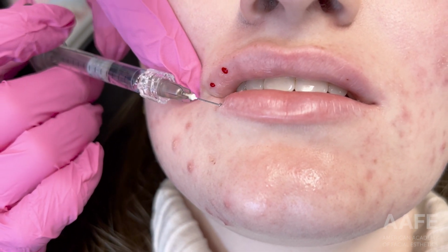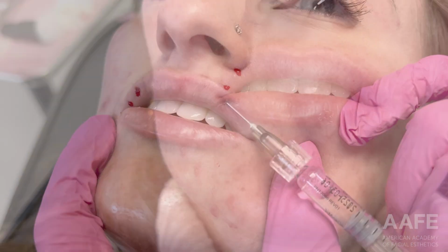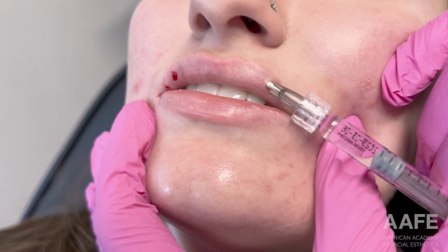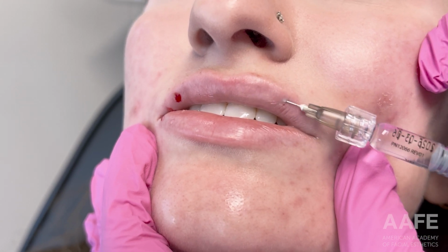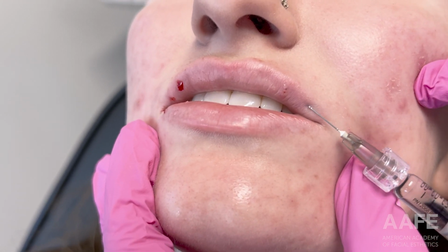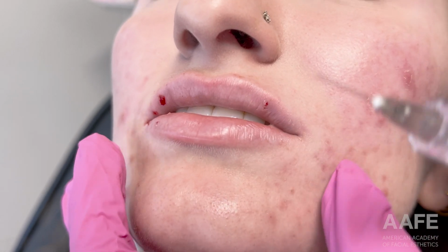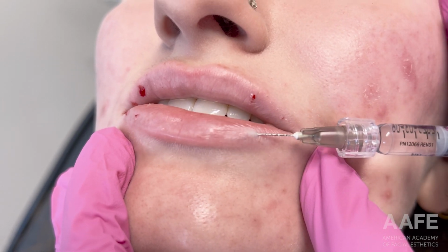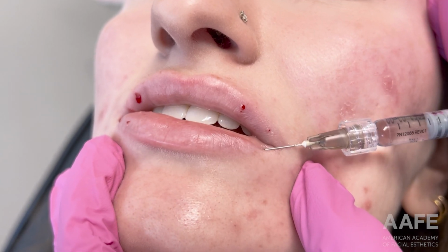You can see here that I did check cap refill on that upper right side of her lip. It was looking a little blanched for a second. Sometimes when you place filler, you can have that. So it's always a good idea to check cap refill, make sure that blood is perfusing and that we like the color of the lip. You can see that went away and cap refill was completely within normal limits. That is always good to see. Here I'm just going in and placing a little bit more product.